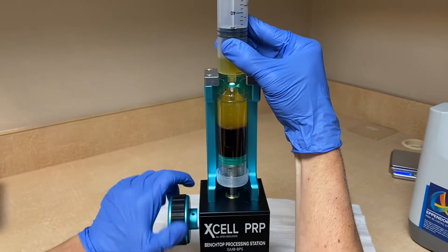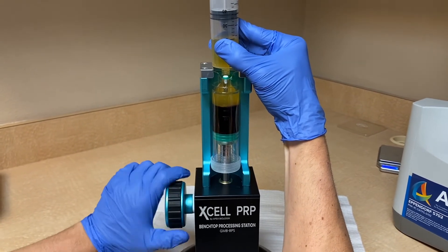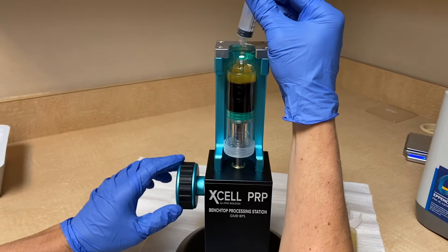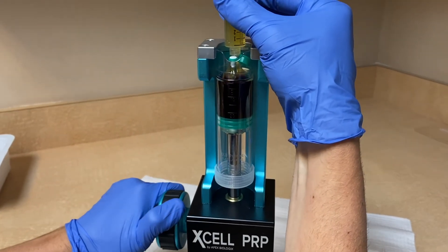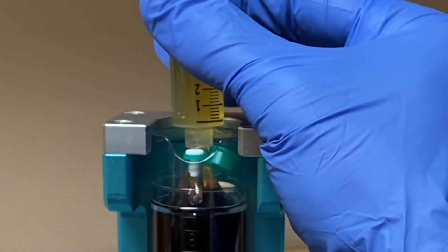They have this concentrating device here, which does make it a little bit easier. You don't have to rely on suction through the tubing. It's very easy to maneuver. A little close-up here — you can easily identify the buffy coat layer.